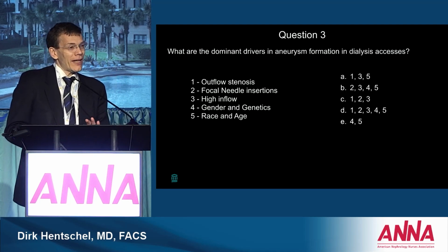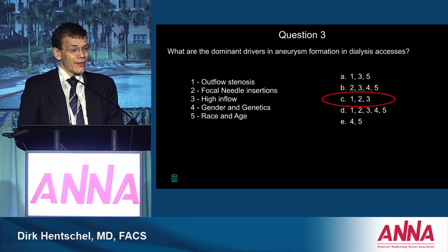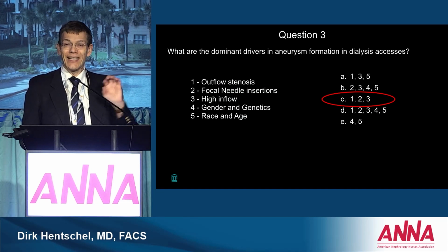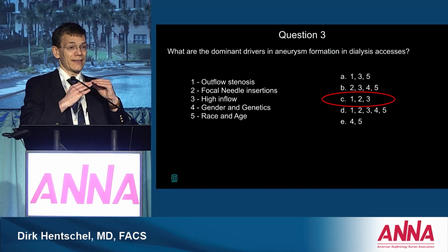The ones that I'm looking for, because this is a didactic talk, are the ones where you have a stenosis in the outflow, where you think about how much blood is coming in and how well you rotate your needles, because healing of needle insertion sites is a process that's affected by how much tension is in the access.